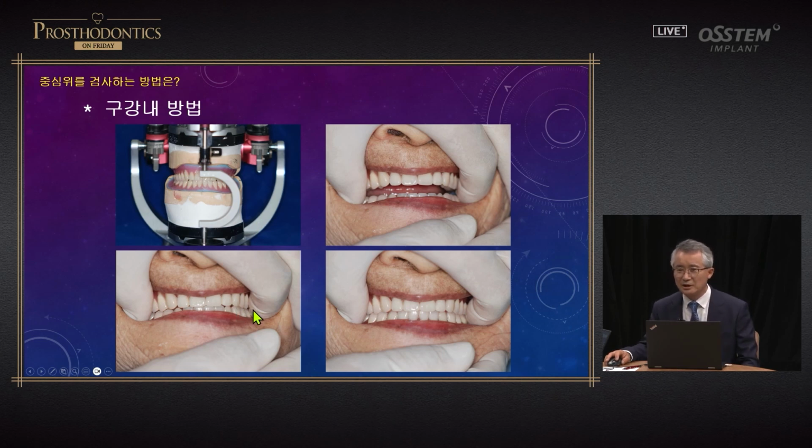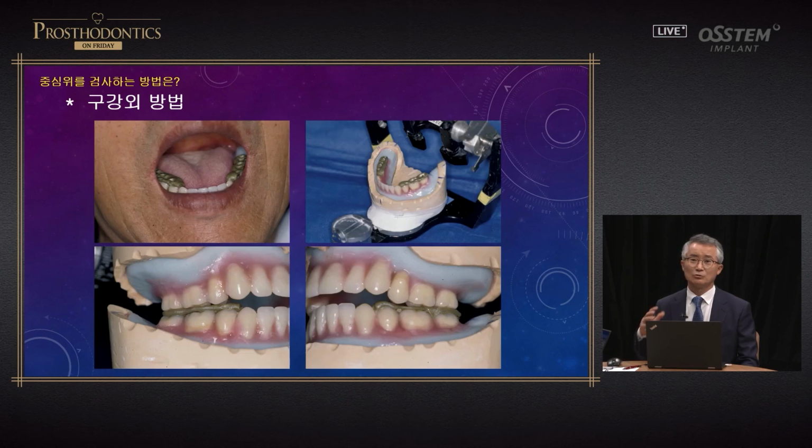When there's slight contact, you tell the patient to stay still and then remove your hands and have the patient move. But I cannot really tell the difference. Honestly speaking, I think this is false. I don't use this method, and I use the extraoral method. When I provide lectures, I tell my students that I do not use intraoral method.